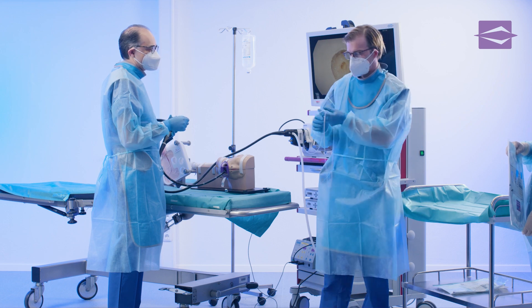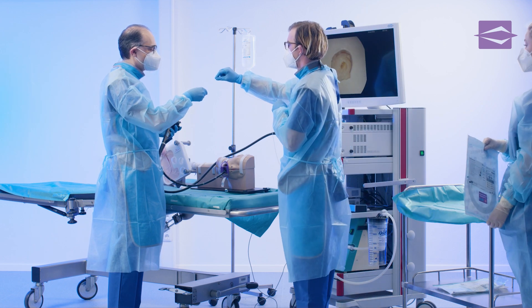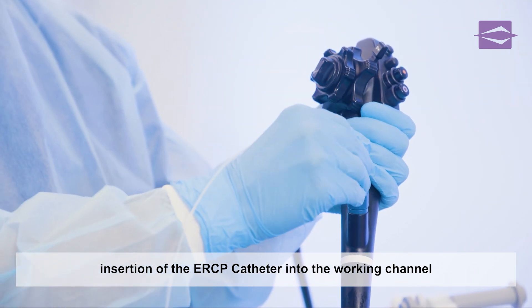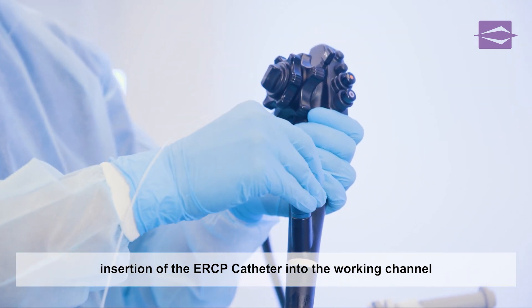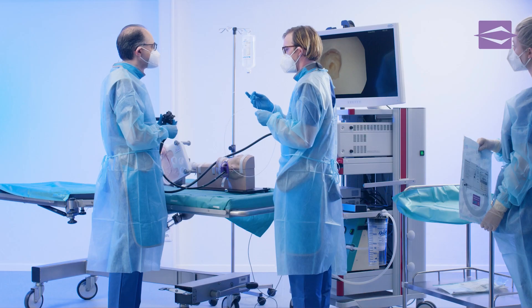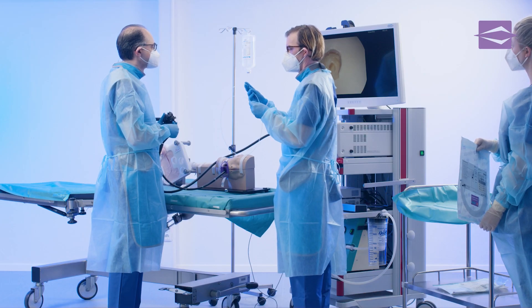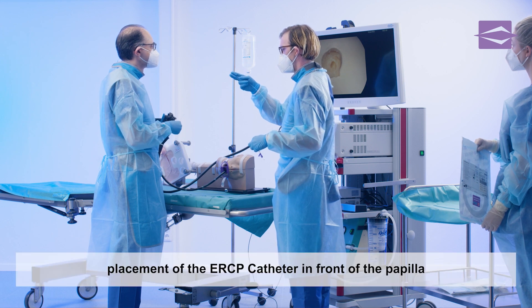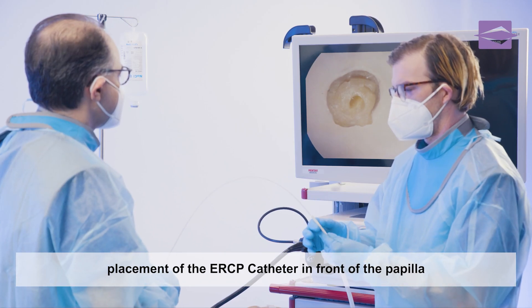The assistant hands the ERCP catheter to the examiner, who inserts it through the biopsy valve into the working channel of the duodenoscope. The distal tip of the ERCP catheter is placed in front of the papilla under visual control.